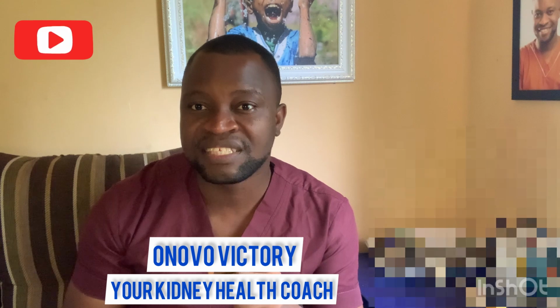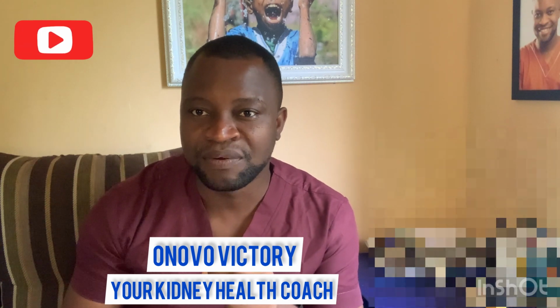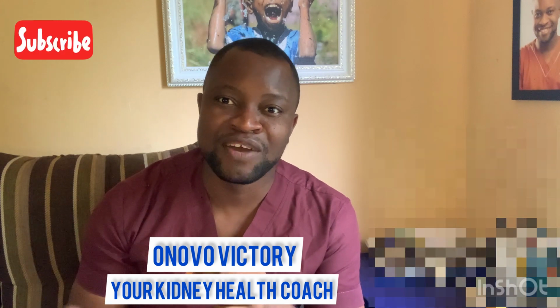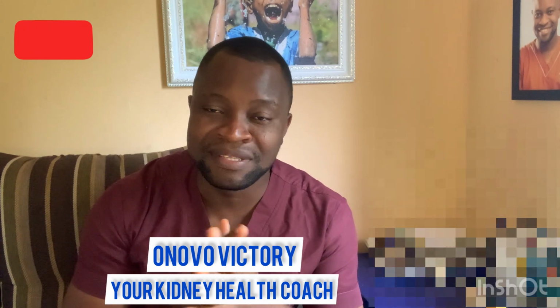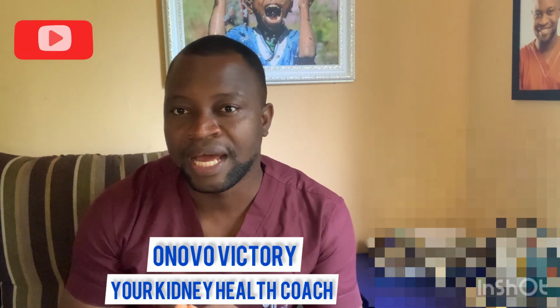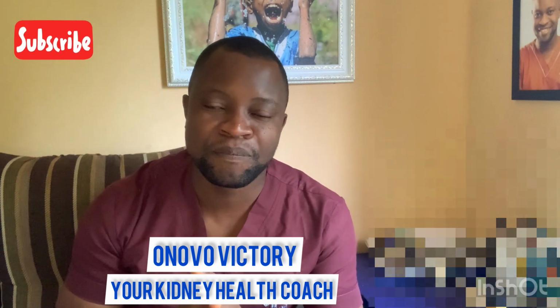Like I said when we started, you write it down. Writing is actually a very important skill, a life skill. Okay, you have to learn. If you're not used to writing or keeping records, this is a time to learn and begin to practice it.